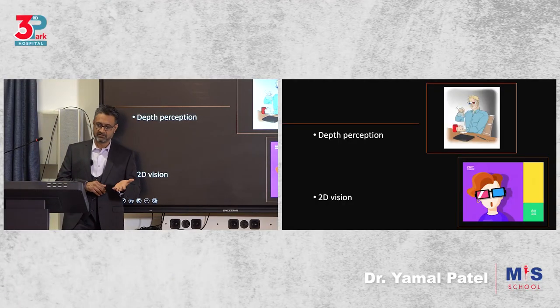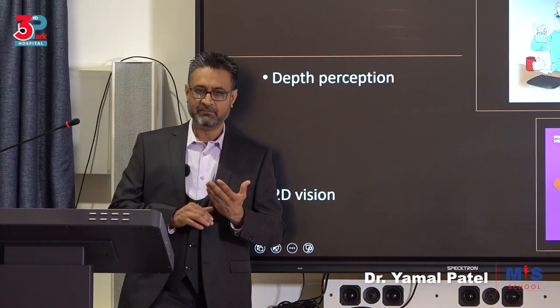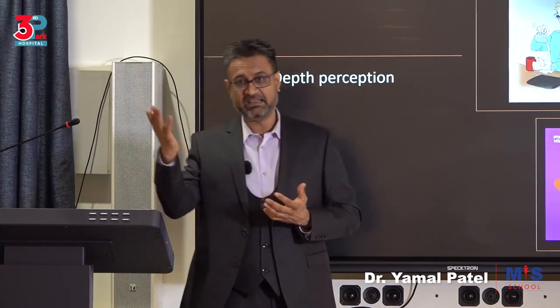You'll need to learn depth. You'll need to learn 2D, because most places, we have 3D laparoscopy in this place, but in most places, you'll be working with 2D laparoscopy.